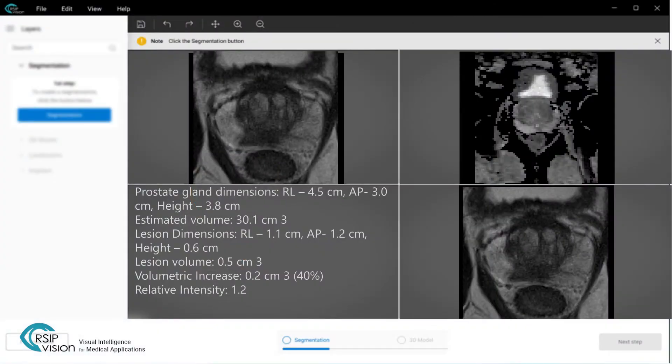RSIP Vision presents the PIRAD's Assistant, a new AI-based tool for supporting PIRAD scoring.